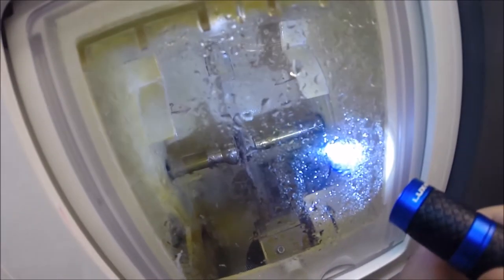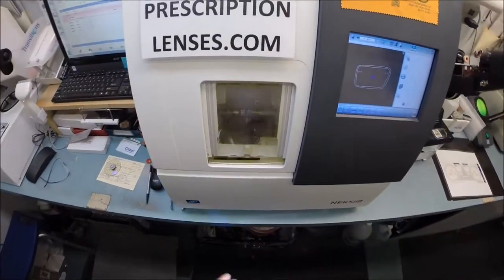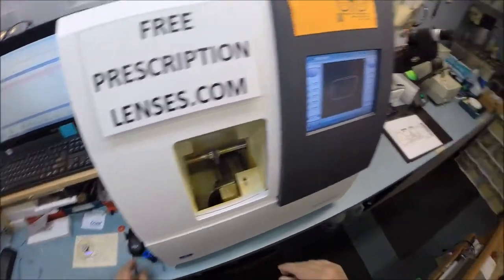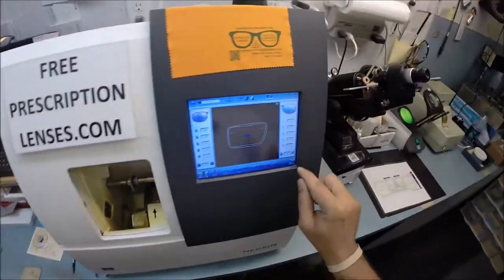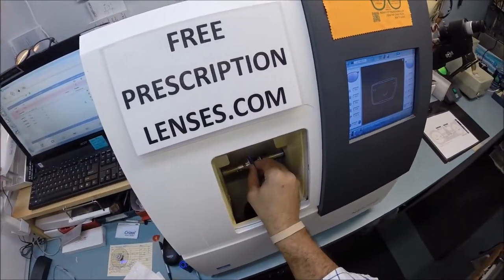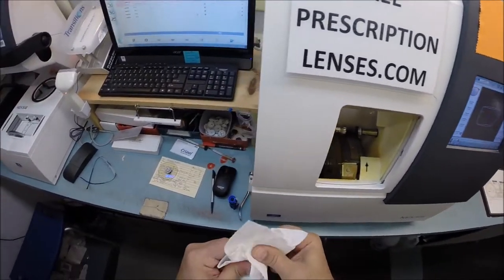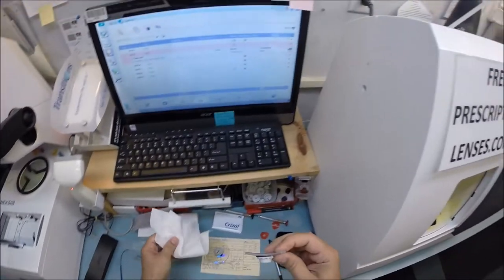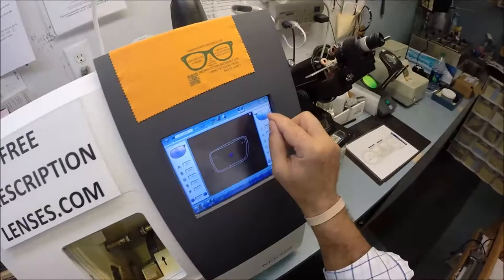The lens is done. In just a moment I will open this door — I can do other things with my mind, I can melt ice with my mind, it just takes me a couple hours — but I'll hit the button to open up the chuck. Out comes the lens. I'm going to dry everything off. That is one complete lens, so let's go ahead and start working on the left lens.